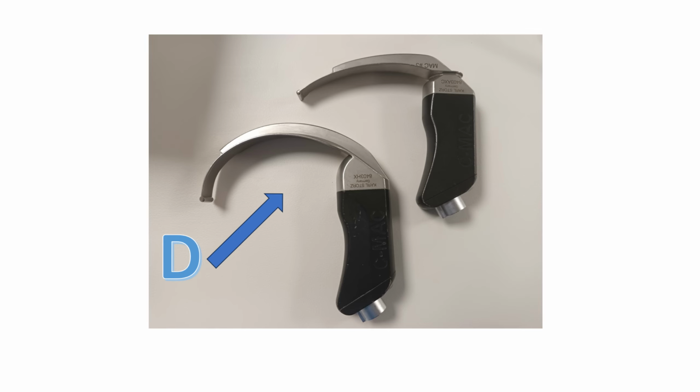The next thing you need to decide if you're going to be doing video laryngoscopy is the size and type of blade that you're going to use. And here I would make the case for always, and I mean this, always using the D blade, which is the difficult airway blade. It's the blade that's got the extra curve on it. It's more curved than the normal blade for difficult laryngoscopy. And what the D blade allows you to do is see the larynx when it's more anterior, when you would normally just see the epiglottis and you wouldn't see the vocal cords at all. So it's excellent in that scenario.